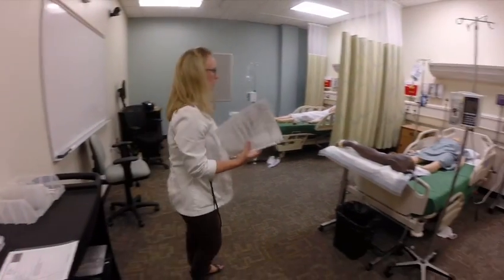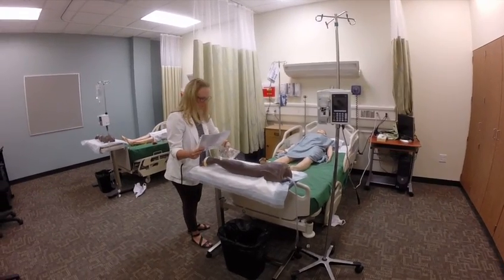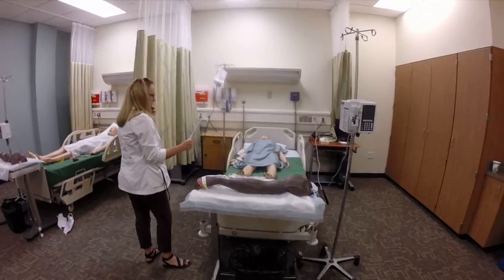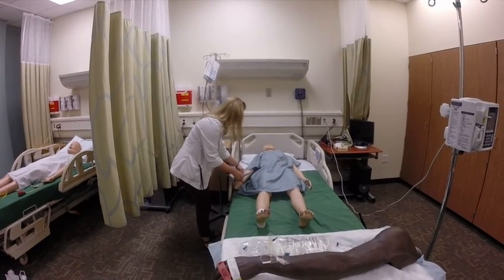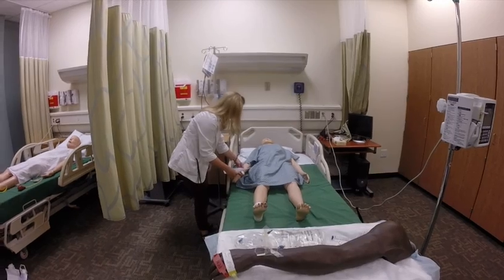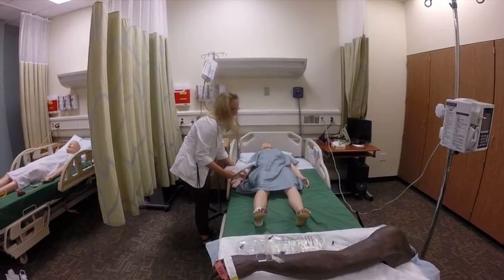So I'm going to go into my room. Knock knock. Hey there, Mr. Smith, my name's Brandy, I'm your nurse. We met earlier with your assessment. I'm going to be hanging some fluids that your doctor ordered. Can you tell me your name and date of birth? Okay, that matches what we have in our armband and our medical record number, 88109789. And do you have any allergies? No? Okay, great.